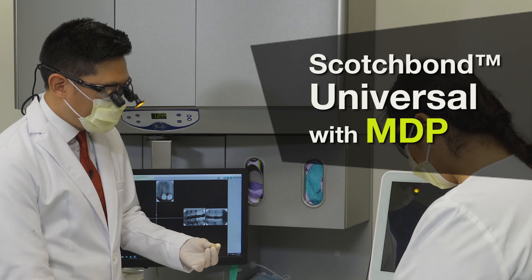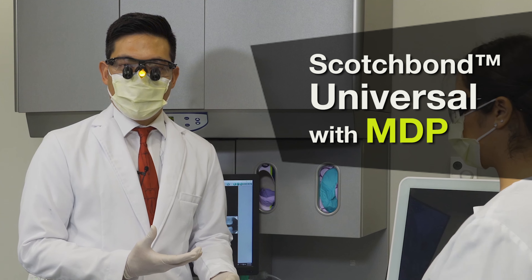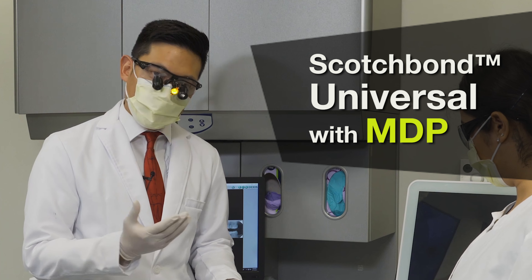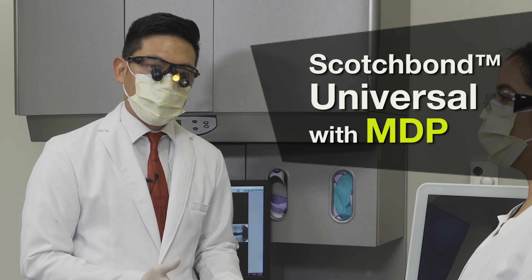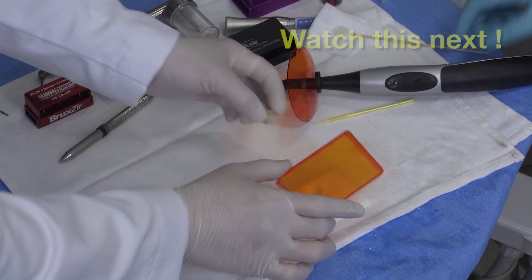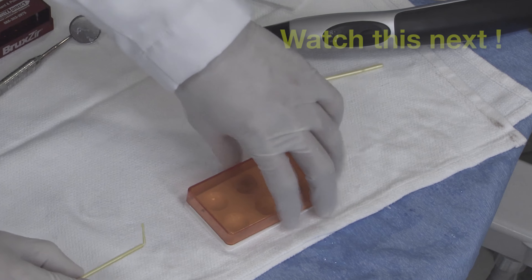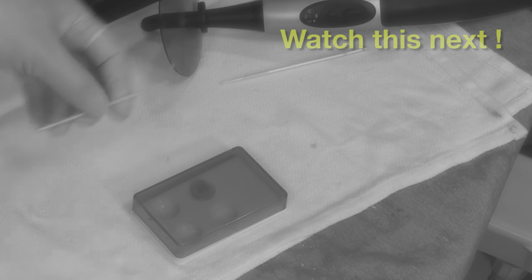The resulting layer will certainly be the bonding agent, and within this universal bonding agent — Scotchbond Universal — there is the MDP primer, which is critical for our bonding to zirconia. So once that's applied, we could light cure this, but I'm just going to go ahead and apply this inside of this protective filter here until we're ready to seat that on the patient. Let's do it.